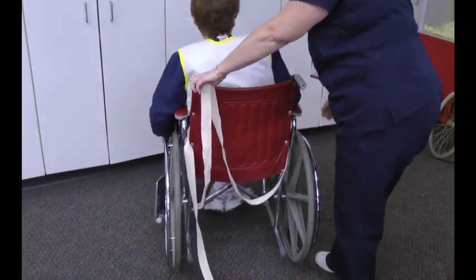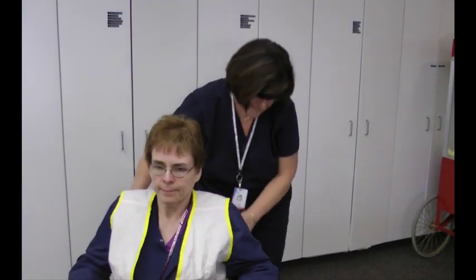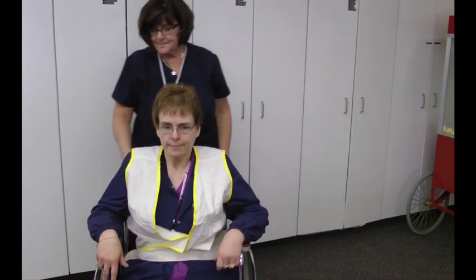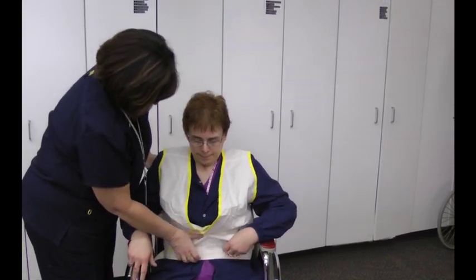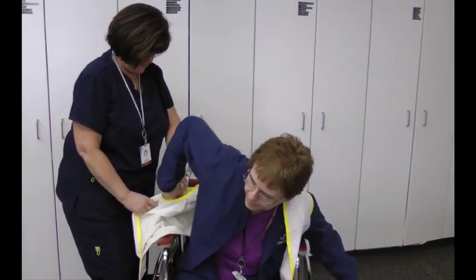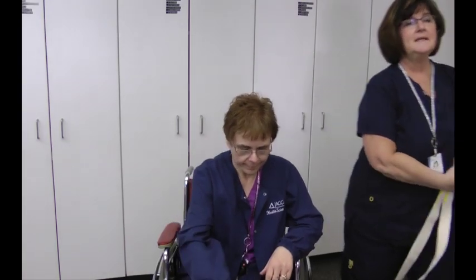Go ahead and unlock that one. So that's a vest restraint. The other, I need you to go forward. There we go. A vest restraint, waist restraint, and wrist restraints. Check every 15 minutes and release every 2 hours.